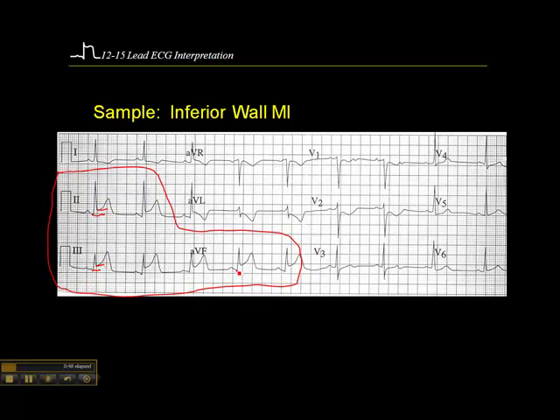And in AVF, we have the baseline here as well. The baseline is the TP line — from the previous T to the following P, that's your reference. And then the J-point is right here.